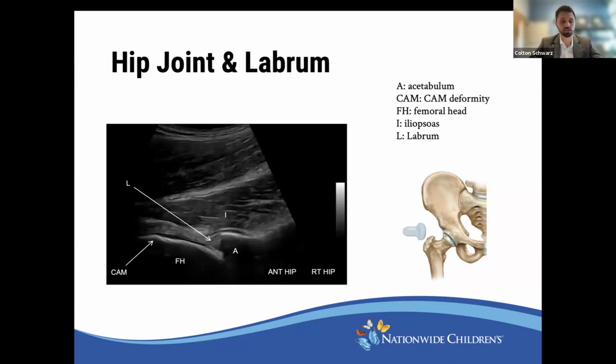All right. So to take a look at the hip joint, we like to start a little bit more laterally along the hip, above the greater troch and underneath the ASIS. So you can slide your probe, our transducer, laterally around the thigh into a more coronal oblique plane.